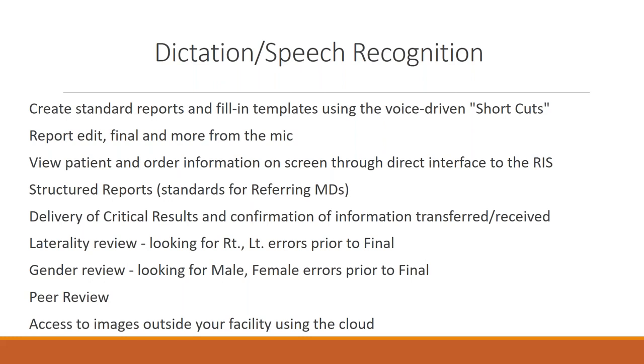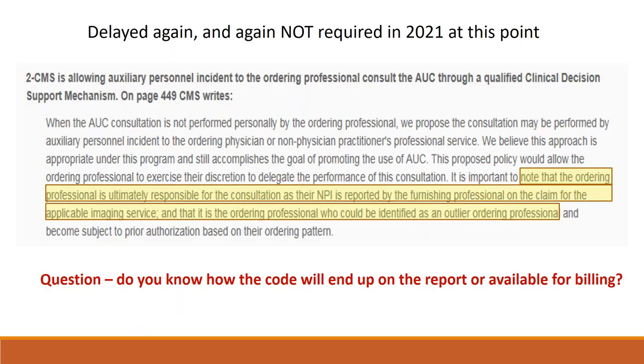We talked about shortcuts and standard reports, making sure of laterality and gender. Peer review, there's software for those items as well. Clinical decision support, we mentioned this earlier on. Note that the ordering professional is ultimately responsible for the consultation as their NPI is reported.